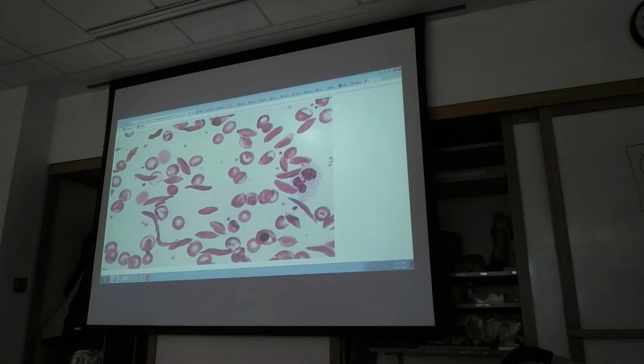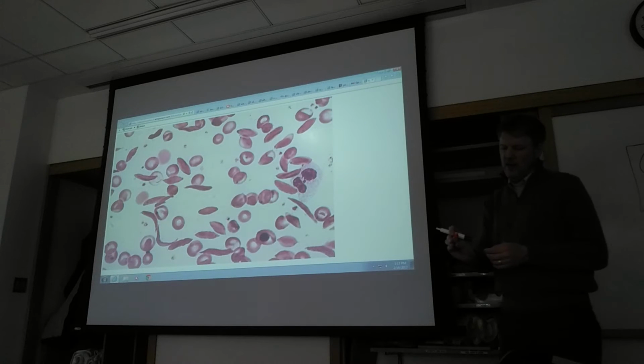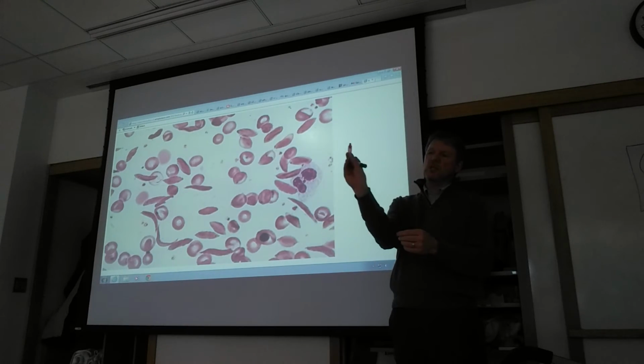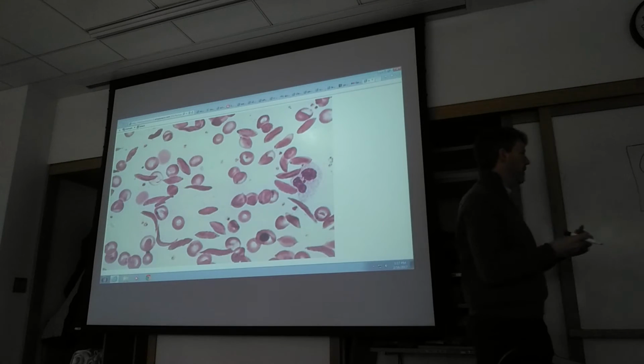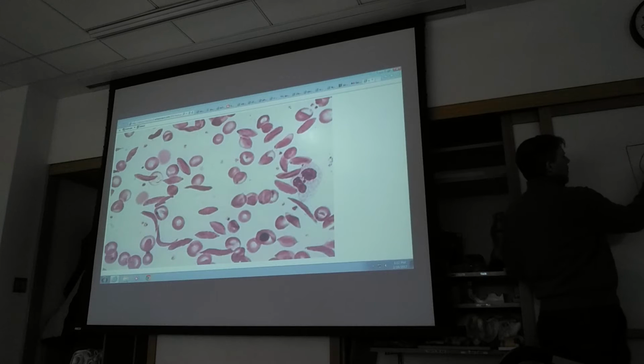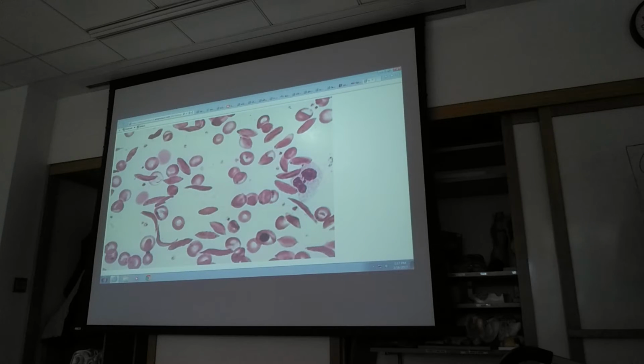What you're going to do is take a drop of the fake blood, and it's so cute. They have different names on them, fake people names. For example, this is Mr. Jones's blood. Anyway, you're going to take the fake blood and drip 1 or 2 drops into each one of these spots. Drip through there, drip there, drip there. And then you take 3 different chemicals.